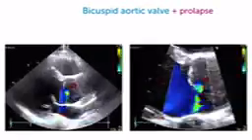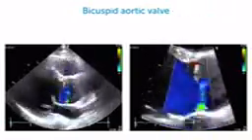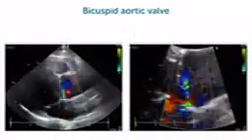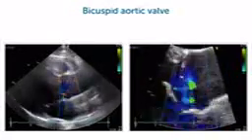And if you look at the color Doppler study, you will appreciate that here we have aortic regurgitation. Now, this is such an example where it might be very, very difficult to detect AR because the jet is so eccentric. It's pointing here downward towards the anterior leaflet. You see that right here, and very difficult to see.